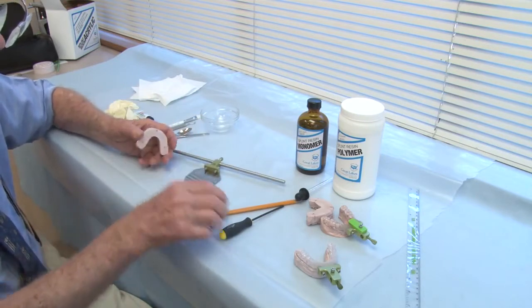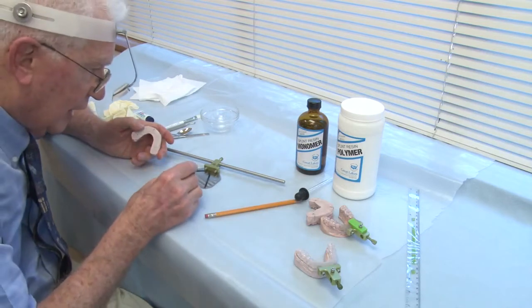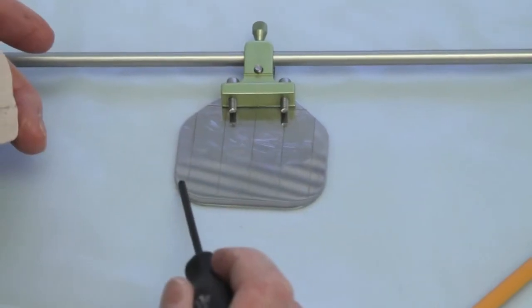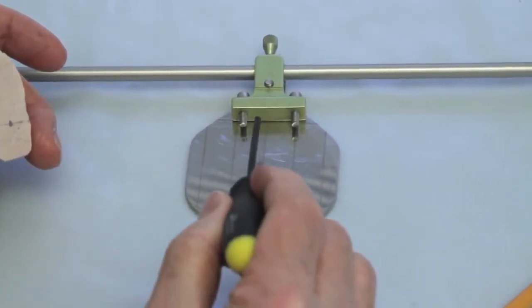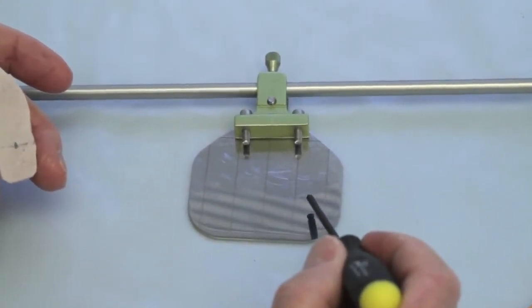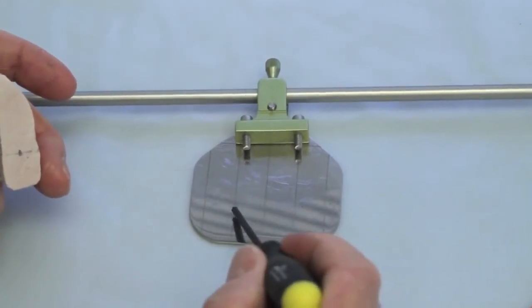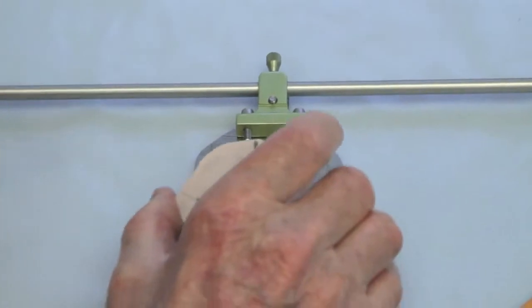You can see on the flag assembly, there's a midline, and then lines equidistant from the midline. We use these lines to line up the center of our lower model and to get our central fossa, lower first molars, equidistant from the midline. So we use these lines to help make that judgment. And so it would fit on like this.